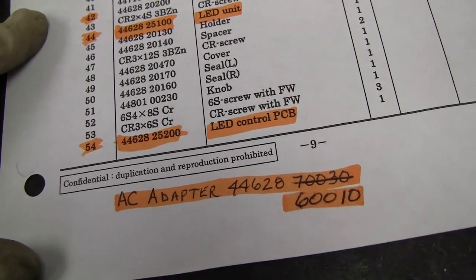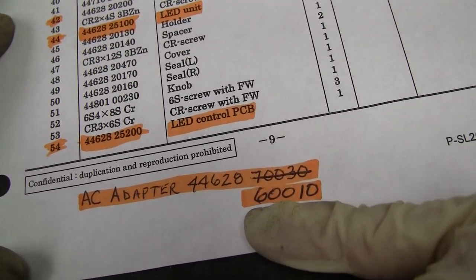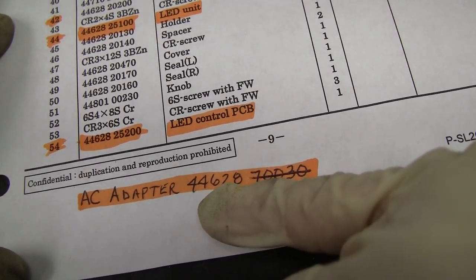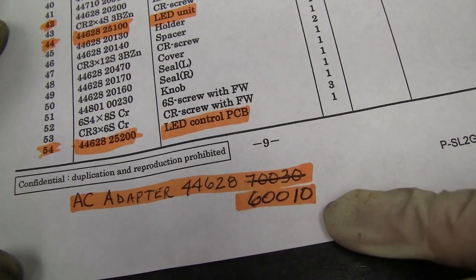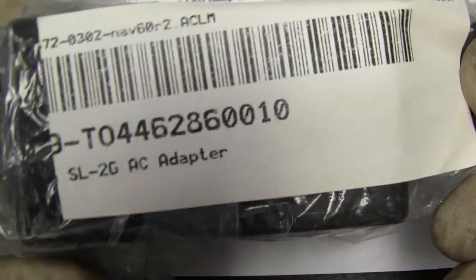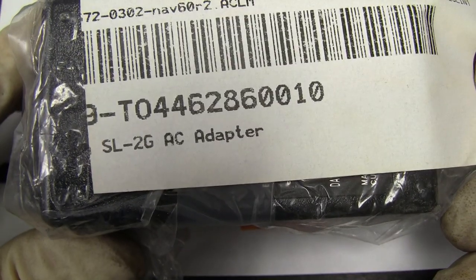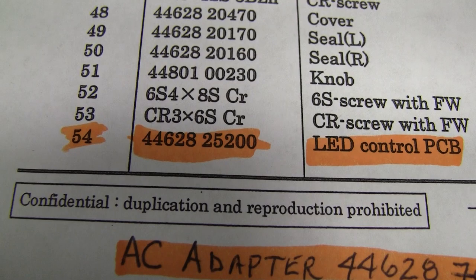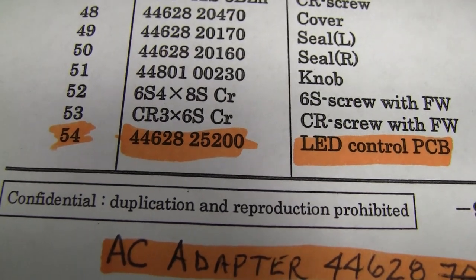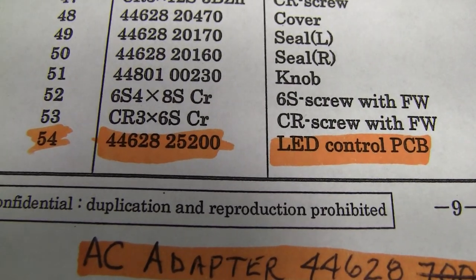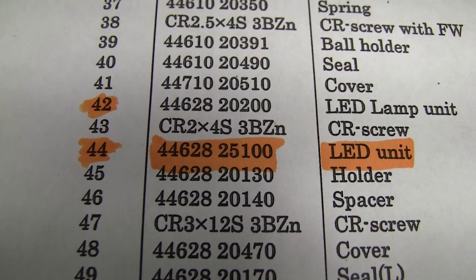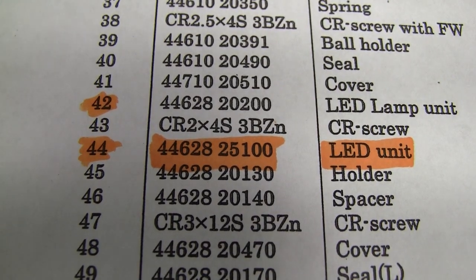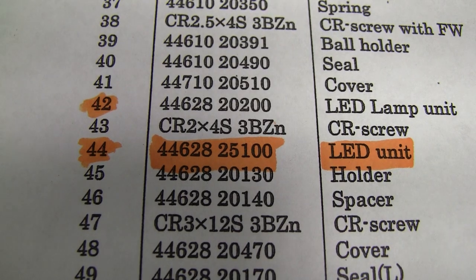The AC adapter for the 2G is this number: 4462860010. That's the LED control PCB, and that's the number of the LED unit itself.